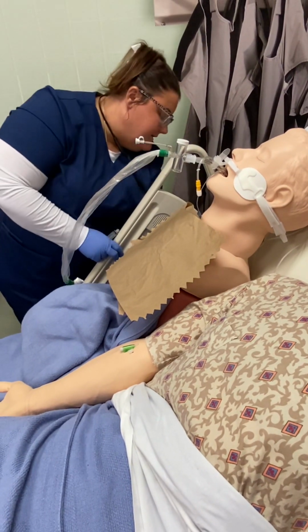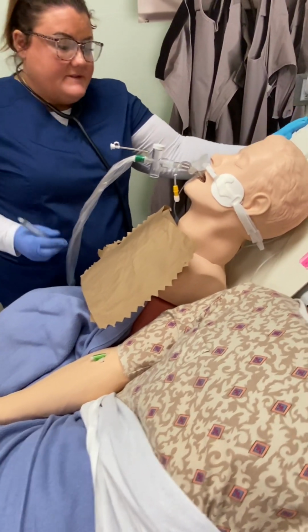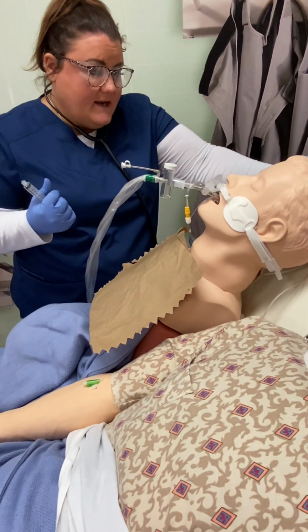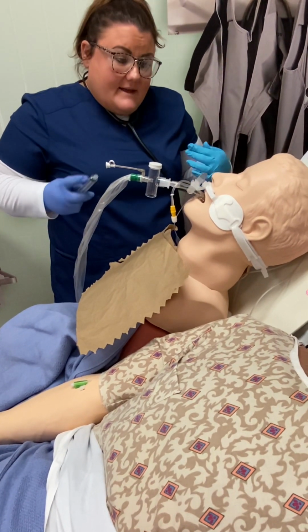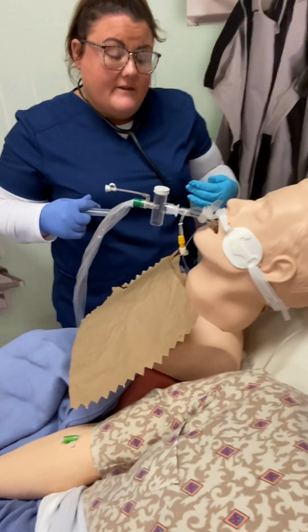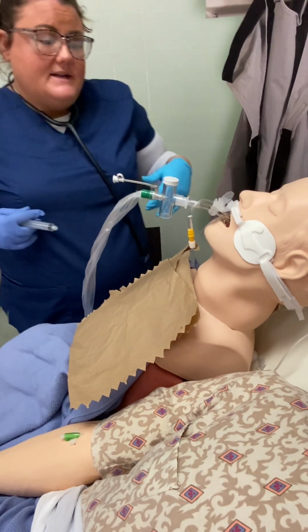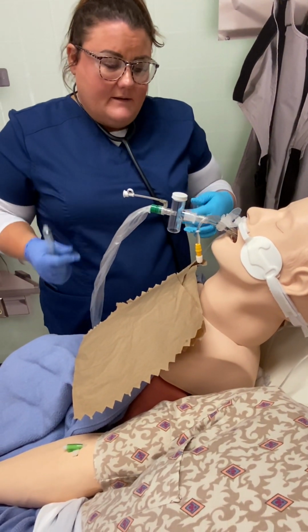All right. So how we're gonna do this, Mr. Smith, is I'll have you take some nice deep breaths for me, okay? After 2 breaths, after that second breath, so the first breath, I'm gonna take you off the vent. After that second breath, I need you to go ahead and take a nice deep breath in. At the end of that, I'm gonna deflate your cuff, and then I'm gonna have you cough, okay? And then I'm gonna suction your mouth out, and then we'll go ahead and get some oxygen on you, okay? So I'll go ahead and just hyperoxygenate him. Go ahead and take some nice deep breaths in. Good. Okay, you're doing great.